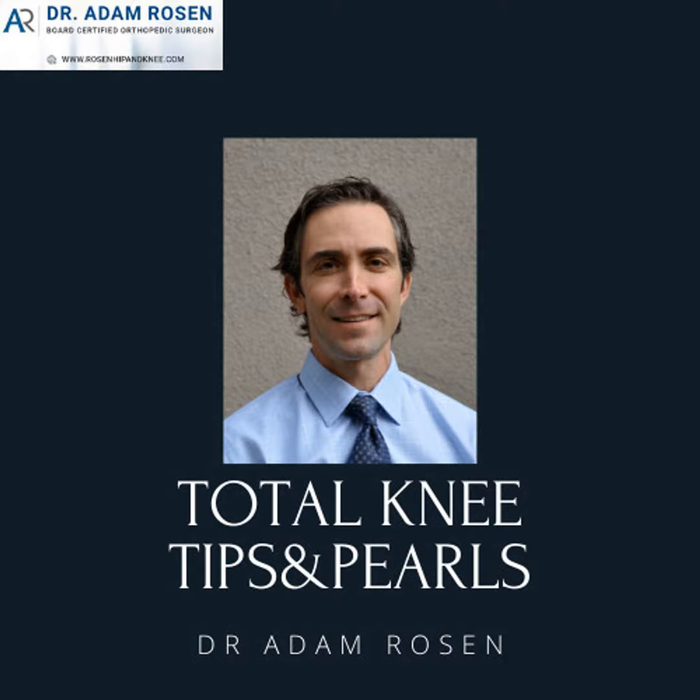And again, one view is no view. You need at least an AP and a lateral, but you can even comment on an AP and an attempted lateral, so it gave you more of an oblique. Your ability to comment on what you see may be limited because you've described that x-ray as suboptimal. In a perfect setting, the tech would have realized it and reshot it, or sent it to the radiologist, who would have said that's inadequate, go back and reshoot it. In reality, they're going to wind up in your office with a suboptimal x-ray more often than you'd like. So you want to make sure of those things.